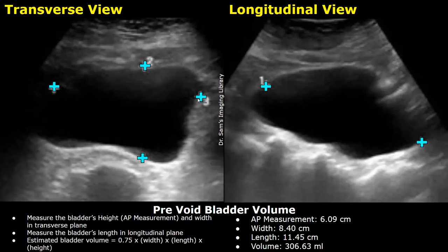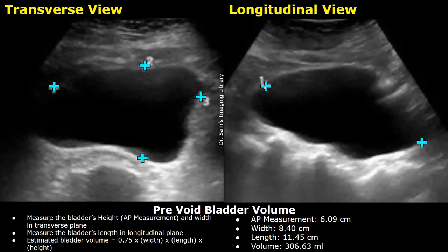After these two measurements, you can measure the length of the bladder in the longitudinal plane. Place one caliper at the superior margin and the second caliper at the inferior edge, again getting the longest dimension possible in the image. This is the length of the bladder.